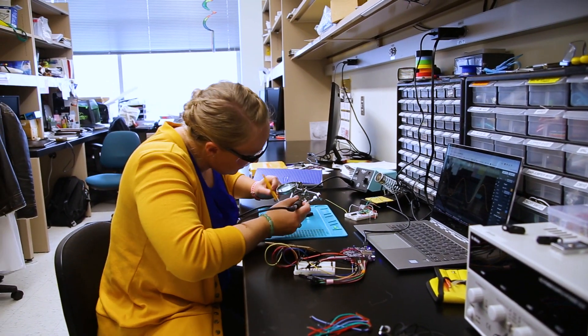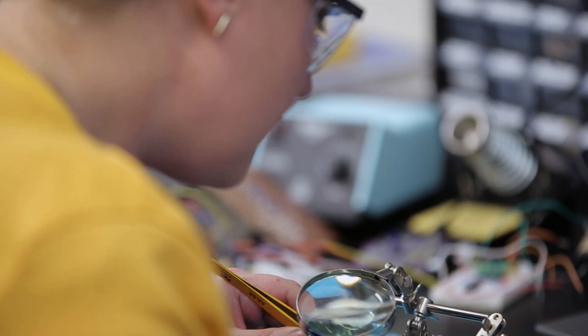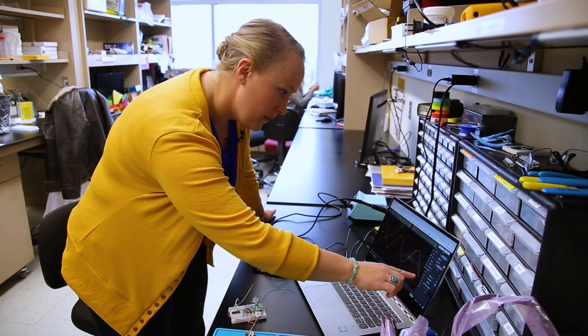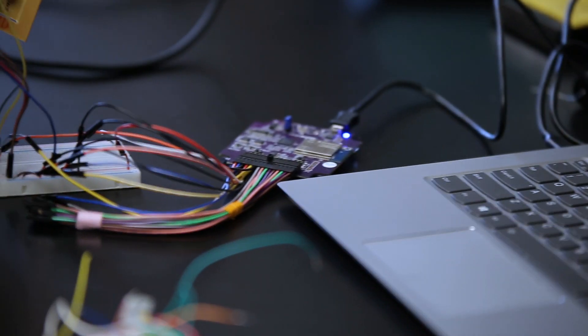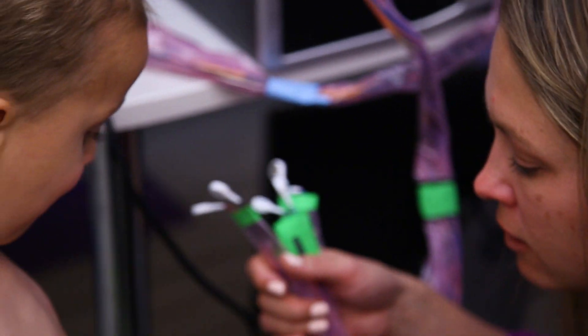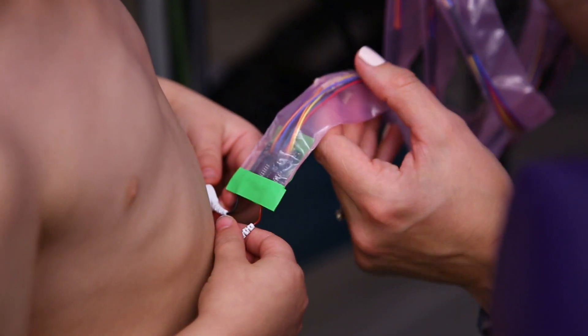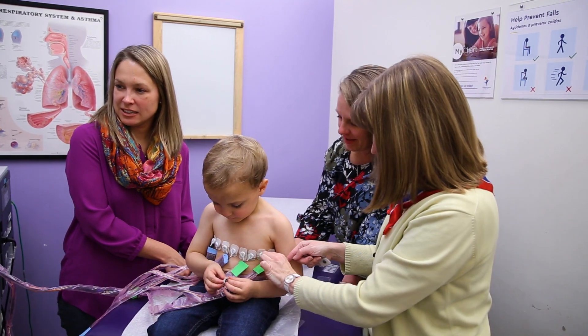In designing this device, you're trying to balance what makes it work best. People are excellent antennas, and there's an electrical potential between the person and all the electronics in the room, creating interference in the data. Mathematicians want to reduce those effects on data quality, while clinicians want a device that's quick to apply and easy to clean. As a biomedical engineer, you're finding the balance between data quality for the mathematicians and usability for the clinicians.